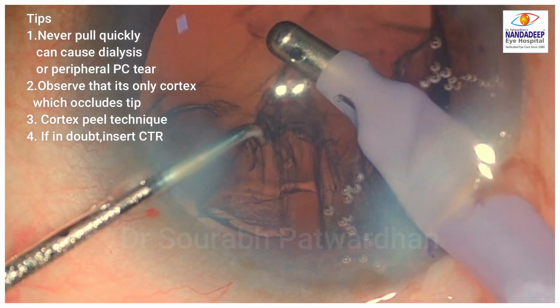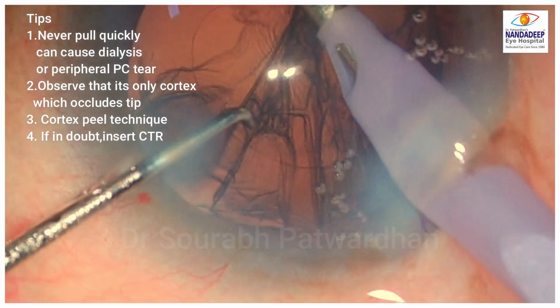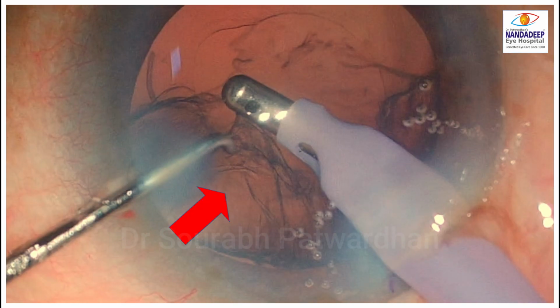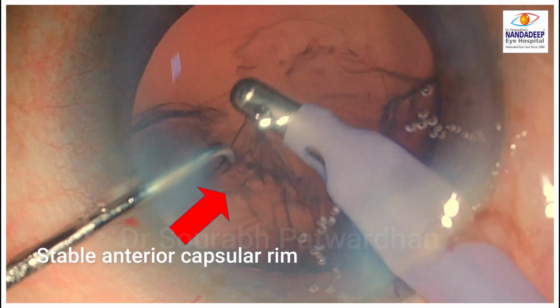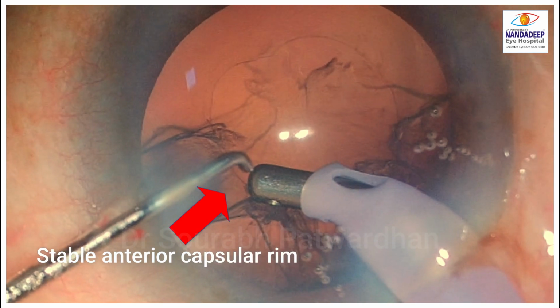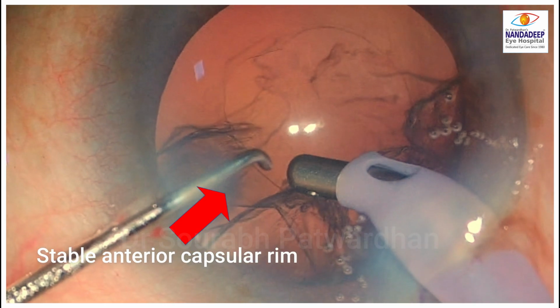A little bit of tangential movements and very slow movement of the probe is recommended. If the instability is more, one can insert a capsular tension ring and then proceed with the cortex removal.